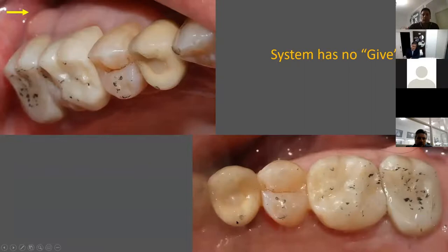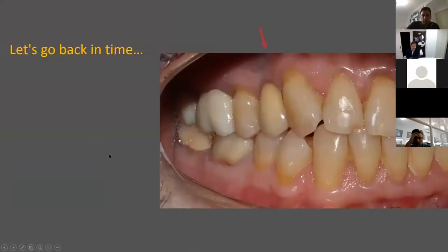He fractured that tooth, he lost that tooth, and his implant's placed here. You've got just fine contact, and then we have a total change in occlusion. And 17 is loaded, you can see the swelling buccally, that's a draining sinus. And obviously here, I have a sign of fracture. And we tend to think, well, let's go back in time. I like being sort of a detective. I like to see why it happened so I can learn from problems, from failures.